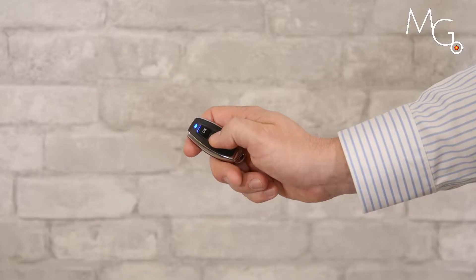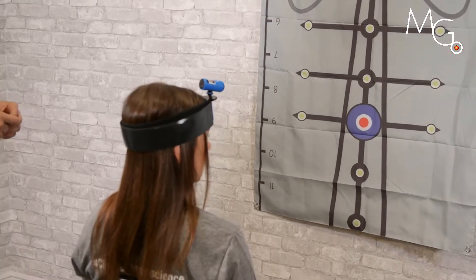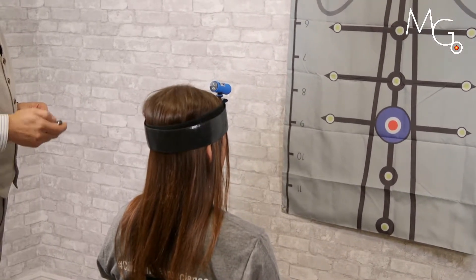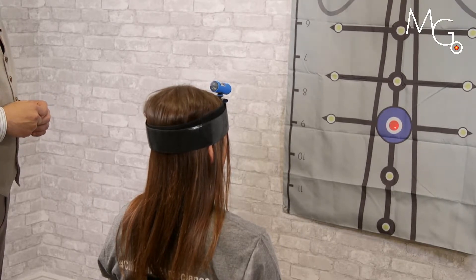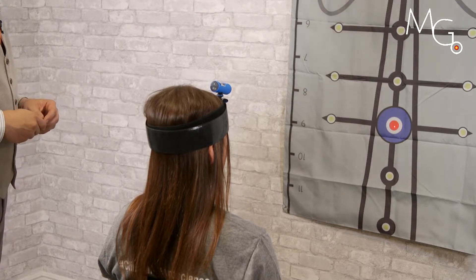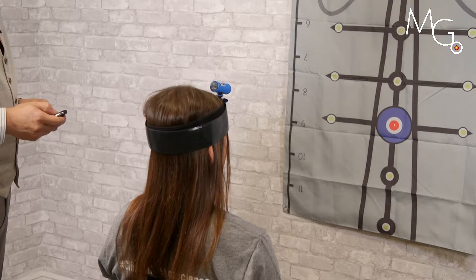Then we take the laser and turn it off, have the patient rotate and come back to where they feel they are in the middle of the target, and we turn the laser on. Any laser placement outside of the blue circle would be considered outside the standard deviation and therefore present with an error.